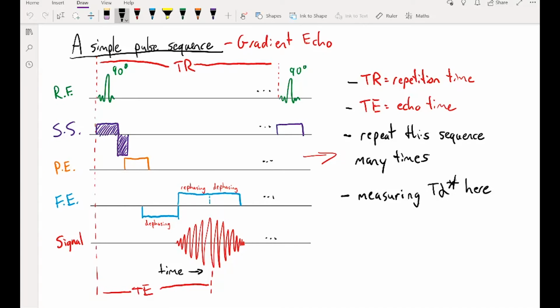The other important part of this diagram is that we introduce differences in phase in any direction when we turn a gradient on. So we need to apply negative gradients, or the opposite of our slice selection and frequency encoding gradients, in order to counteract the phase that we don't want accrued or encoded in that direction. That's what the boxes below each line represent. That allows us to collect this echo, which is the signal from the spins, or protons, that we're collecting from.